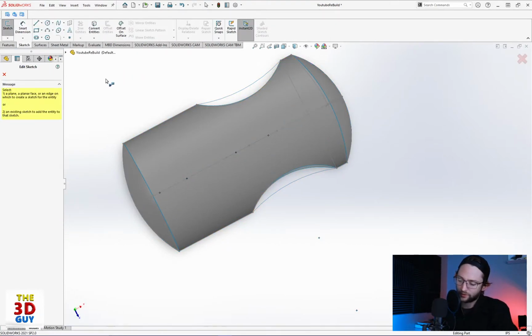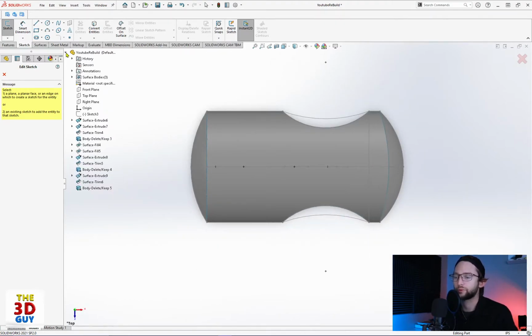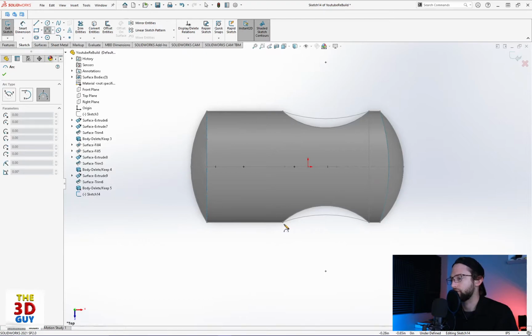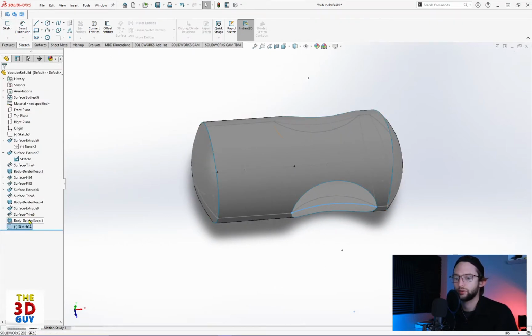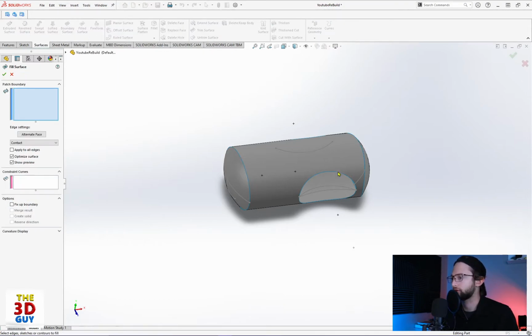So yeah, there's a lot of different ways that I could tackle this project. I'll admit I have modeled this multiple times to prep and set up this demonstration. And so there's really all sorts of things I could have done differently. But this is just for what I'm showcasing. I feel has been one of the better options. All right. So we have that line there now. We'll do a fill surface again.